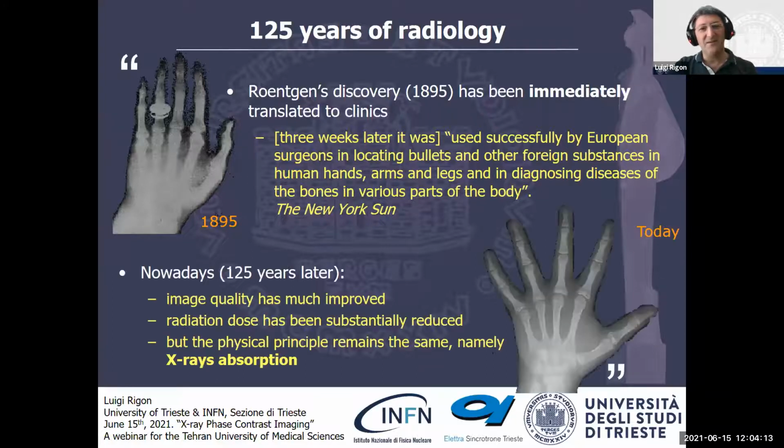Now, of course, more than 125 years have passed. We can say that the image quality has much improved, and the radiation dose has been substantially reduced. But another thing that is quite striking is that the physical principle that we use nowadays is the same that was used by Röntgen, namely X-ray absorption.